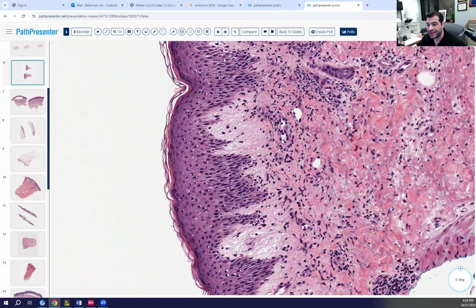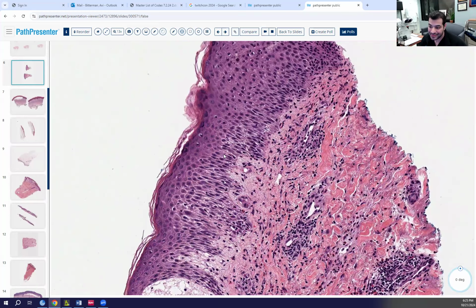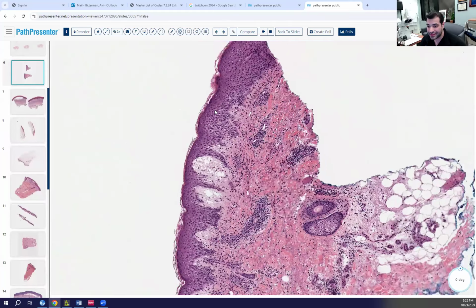Okay. Good. Are we thinking something like IP? Probably not. Good. Okay. And what did this one end up being? This one was herpes gestationis. Good.